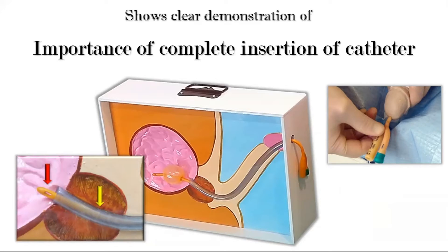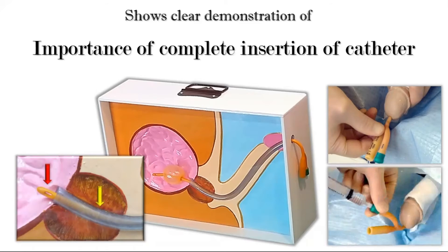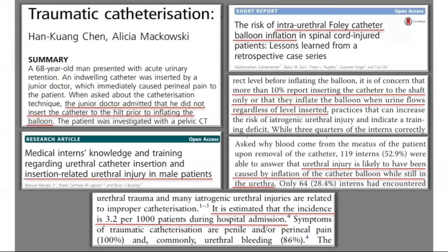Inflation of the balloon at this stage will cause serious injuries to the urethra. So regardless of the age, height, and weight of the patient, the balloon should be inflated only after complete introduction of the catheter inside the male urethra. This rule is supported by multiple publications from all around the world, which have highlighted the seriousness of this injury and the importance of proper training for students.